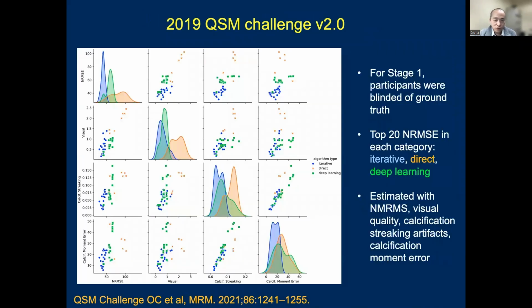As a result of such limitations, the deep learning-based QSM actually didn't outperform the conventional approaches in our second QSM challenge.